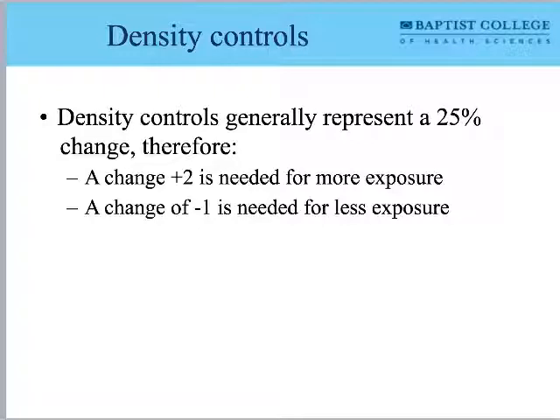So that's no longer the case. Digital has pretty much solved a lot of those problems, and it continues to solve a lot of those technical problems of overexposure and underexposure. We're relying on the digital system to do a lot of that. Your main job now is to be involved in the risk to your patient, and to advocate for their interests as we're using radiation.